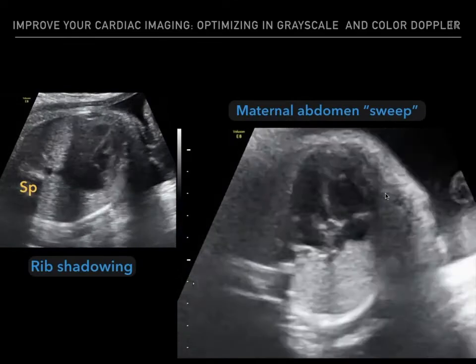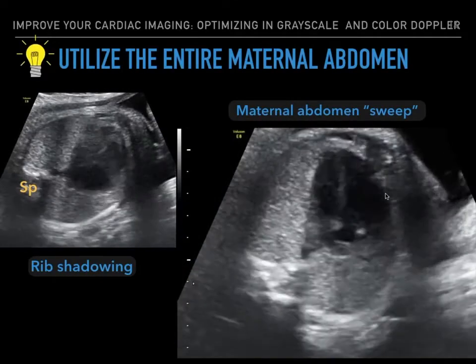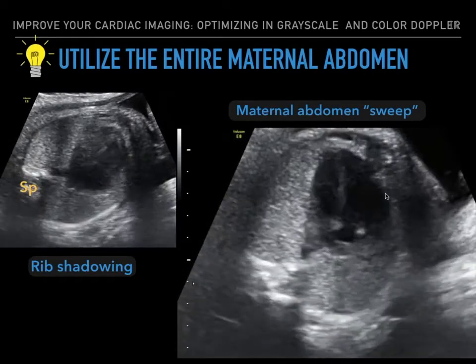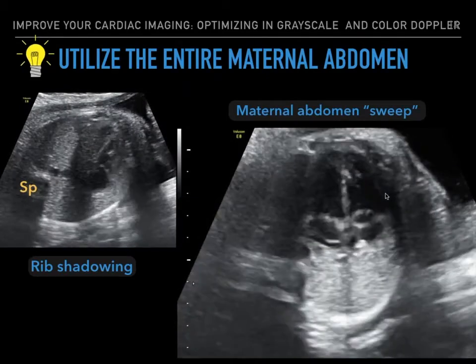What you could actually do is utilize the entire maternal abdomen. You want to sweep your probe high, you could even sweep it low, move over to the maternal left and right, and explore your different angles to avoid the rib shadowing.